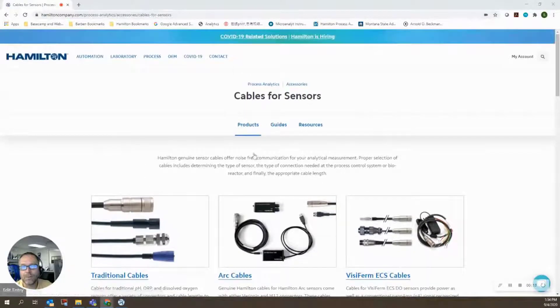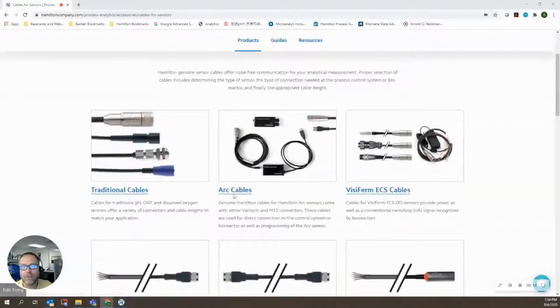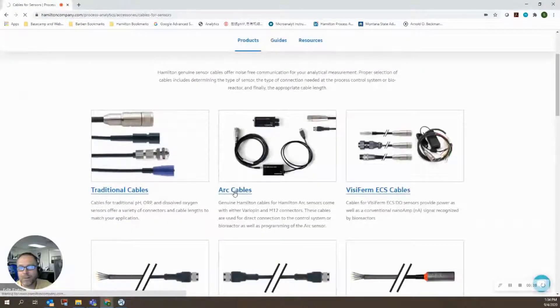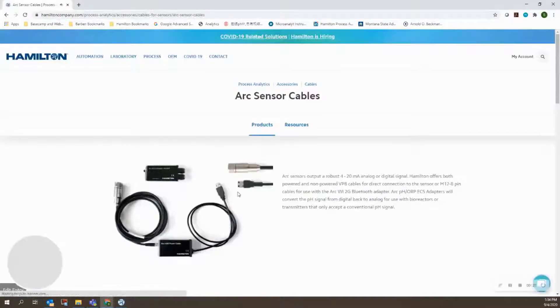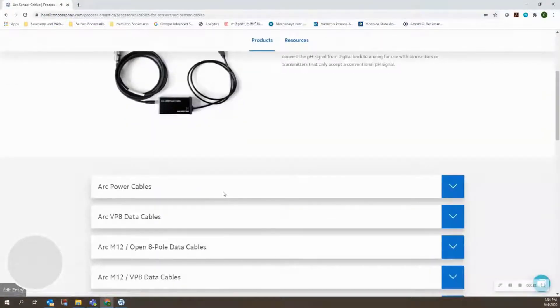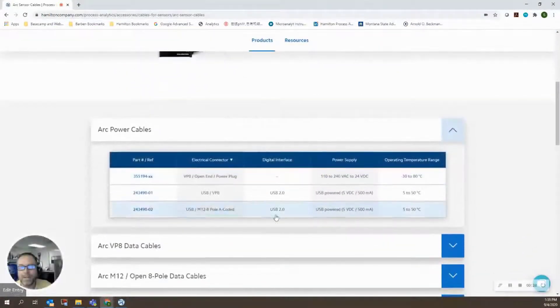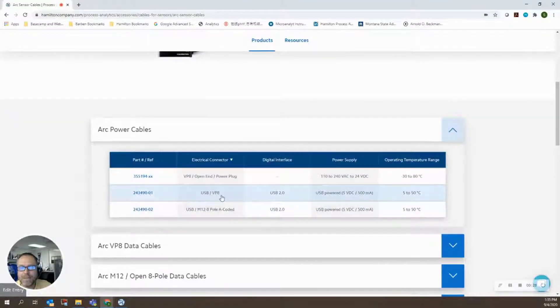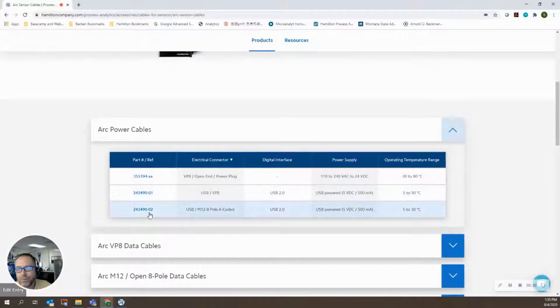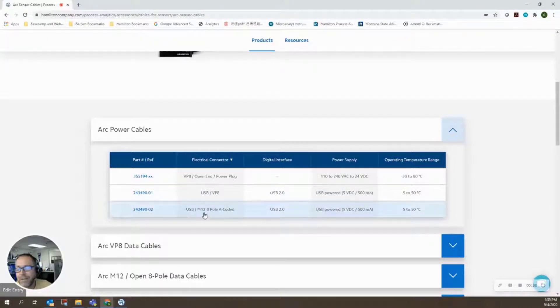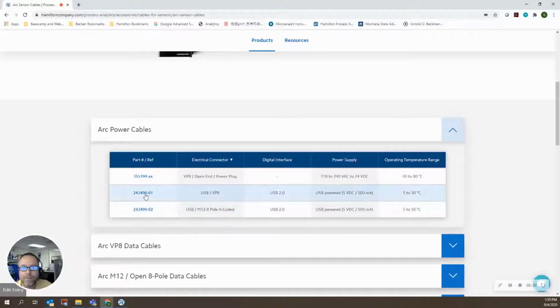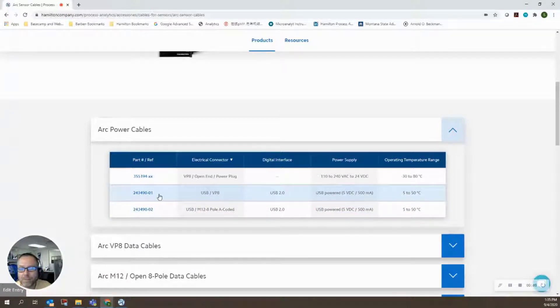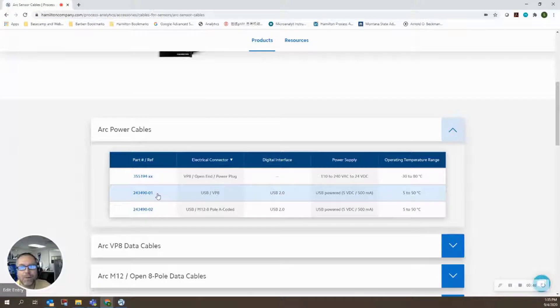So I'm going to go under cables for sensors. These are ARC products, so we'll look at ARC cables. Under ARC power cables, there's two versions: there's a dash 01, which includes the VP connector for direct connection to the sensor, and there's a dash 02, which has the M12 connection for connection to a W2G. This is probably what we most commonly do, directly connecting sensors to the computer using the VP connector.